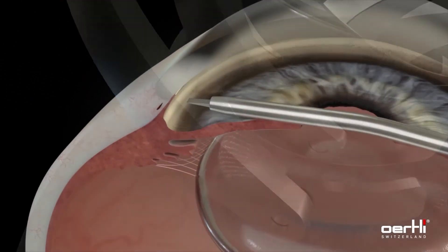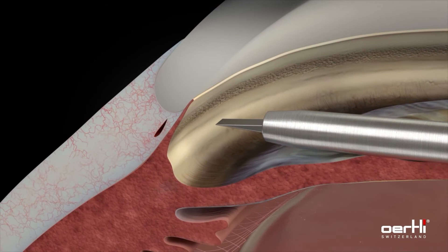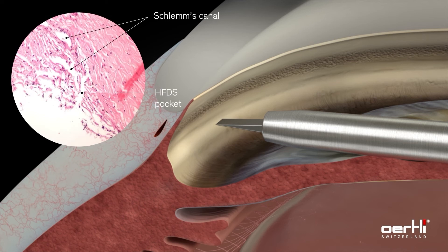Place the tip at the level of the pigmented trabecular meshwork. Using high frequency energy, six small pockets are formed, which significantly reduce the outflow resistance for aqueous humor.